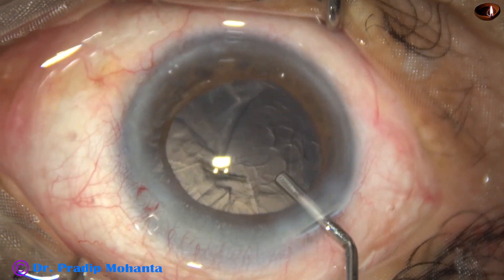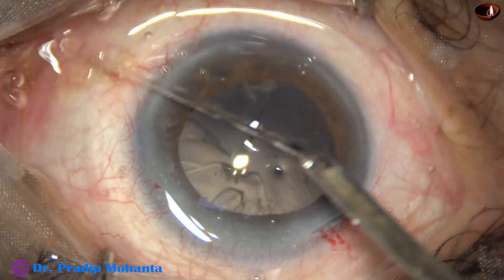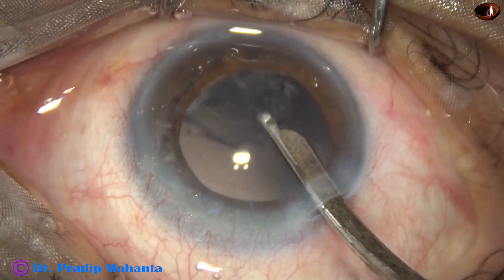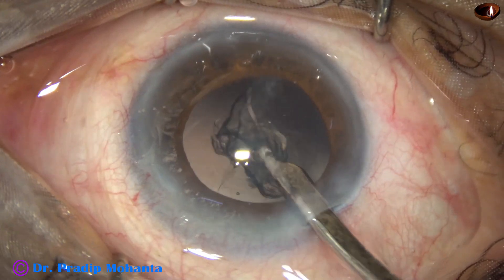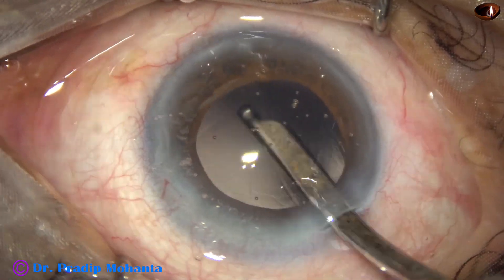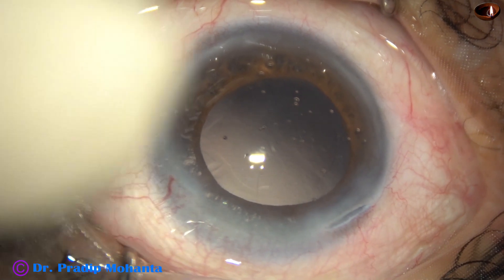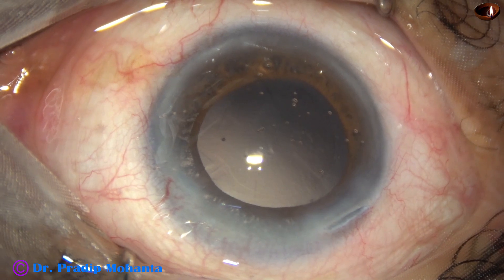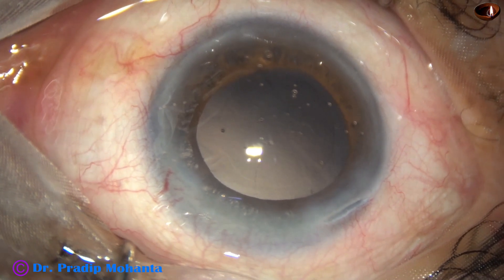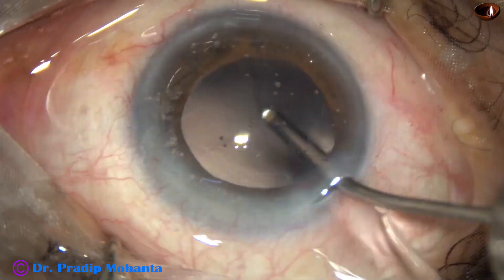The anterior chamber is filled up with 2% hydroxypropylmethylcellulose and the remaining cortex is removed by Simcoe cannula. A coaxial I/A could also be used, but there is only one side port so bimanual cannot be used. The posterior capsule is polished by the Simcoe cannula, but this is not sufficient for a retinitis pigmentosa case, as the rate of capsulophimosis is very high. We must polish the posterior capsule and as much as possible of the equator of the capsular bag.